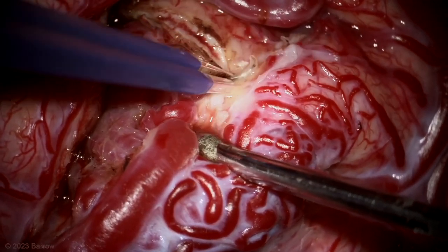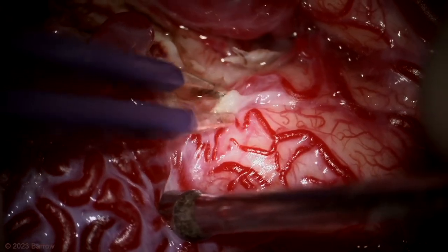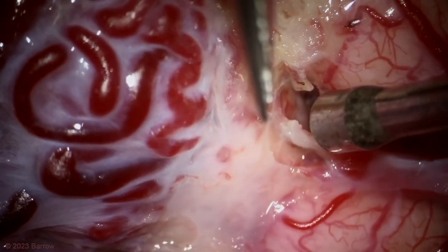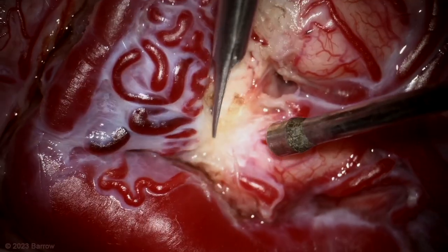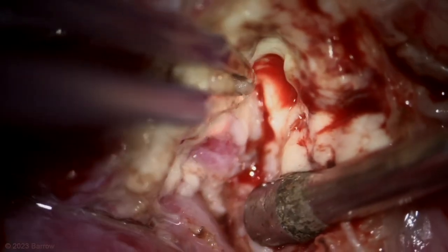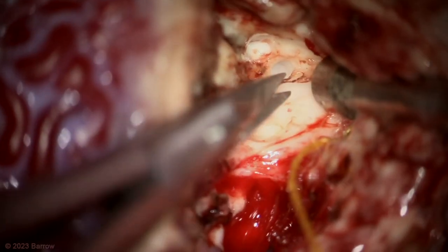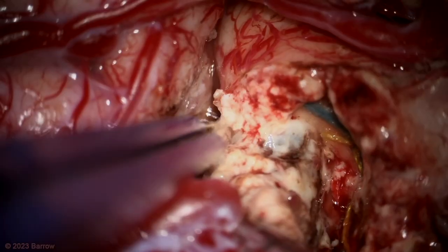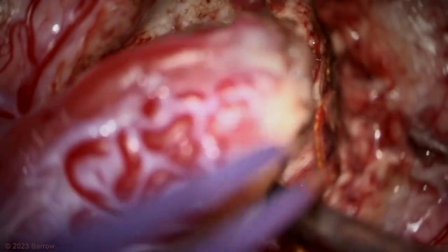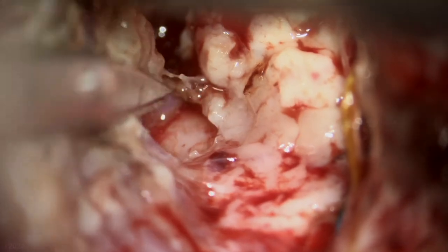Now is the time to go across this anterior border. We know that the AVM is very close to the somatosensory cortex, so it's important to really hug the AVM tightly. You can see that I'm making my peel incisions here as close to the AVM as possible, and as I get into the parenchyma, you'll see the nidus to the left, and with some retraction on the nidus, you can see some separation plane developing. The inferior anterior aspect of the AVM dissection is being developed, and the AVM is peeling away very nicely from that anterior border.